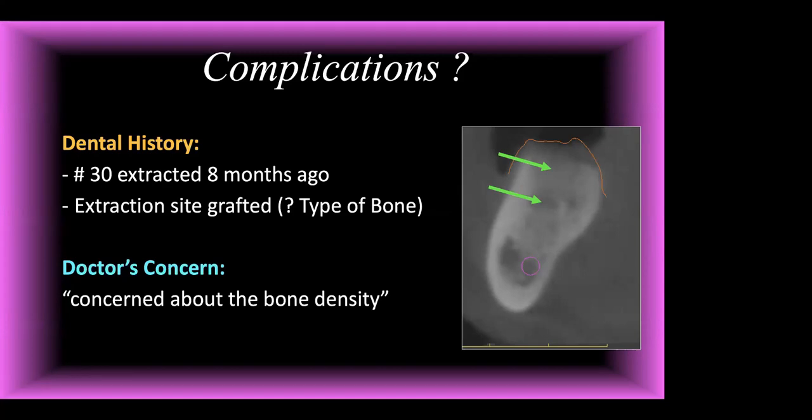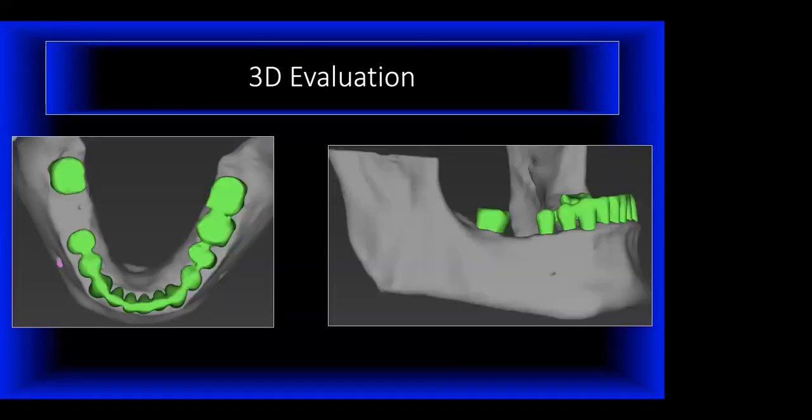Was it an autograft? Was it an allograft? If it was an allograft, was it demineralized or mineralized bone? Was it a xenograft? Or was it an alloplast? So you could be looking at a bone that would be very favorable, or a bone type that would be very unfavorable. And again, we'll go through that as we go through the case.